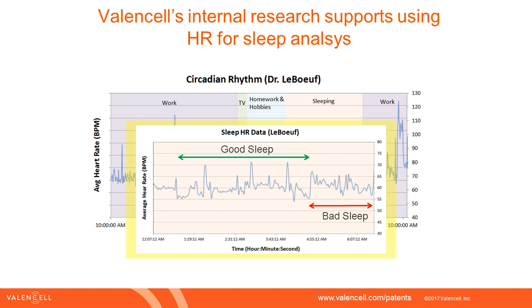And so you'll see this. Now you look at this, and as a human, you go, oh my God, I totally see it here. But you've got to remember, a big thing about wearables is trying to make this autonomous, to where a computer could look at this and pull this off. And that's non-trivial for a computer to look at this and say, okay, I see the stages, I get it, and this is bad sleep.